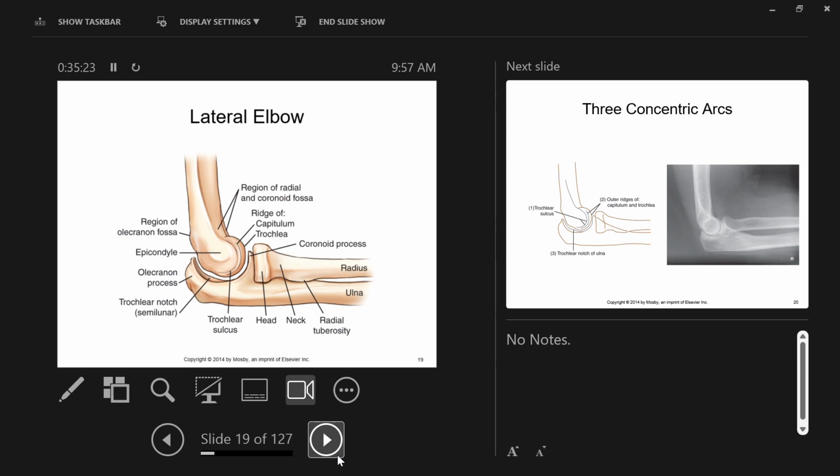However, what happens often, see how low I have to get to make that happen, right? Typically patients are seated in a chair, okay? So what often happens is, because they're seated in a chair, my forearm, radius and ulna, are parallel flat to the tabletop, but you'll notice when I sit up a little bit, my humerus now makes an angle to the table, okay? So you're not going to see a true lateral of my elbow in this case, okay?